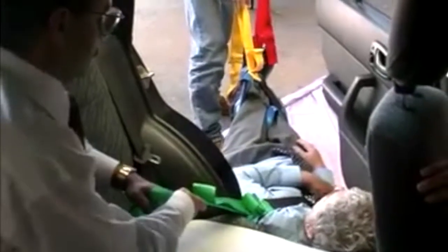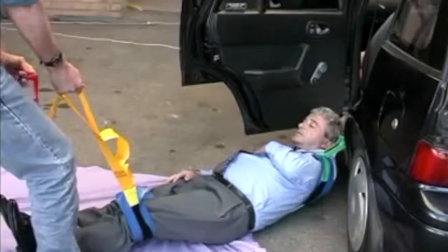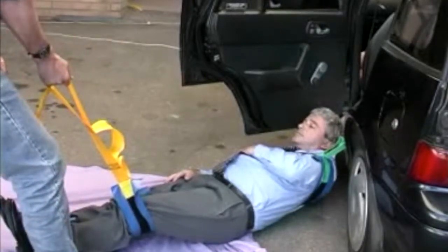The patient is being lowered onto the ground from inside the vehicle. The person inside the car is controlling the slide speed with the chest strap by pulling backwards. The person using the thigh and ankle straps controls the direction of the patient.